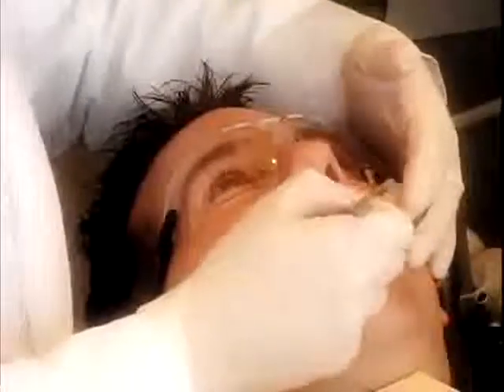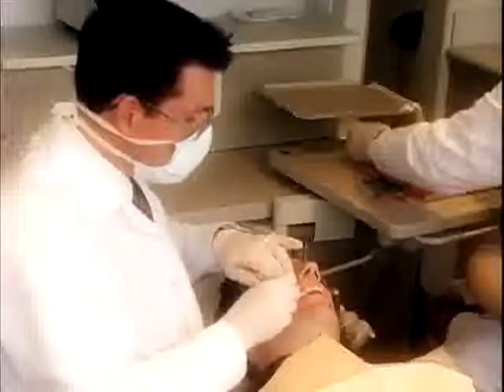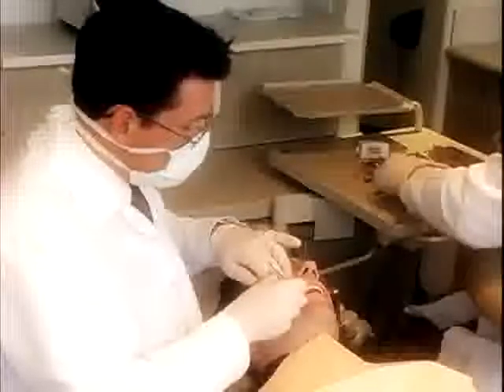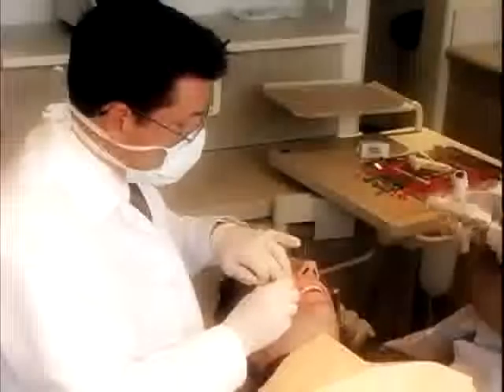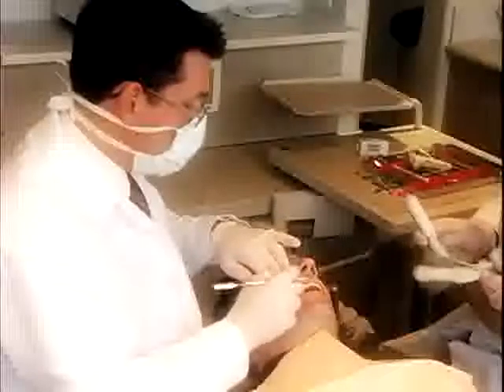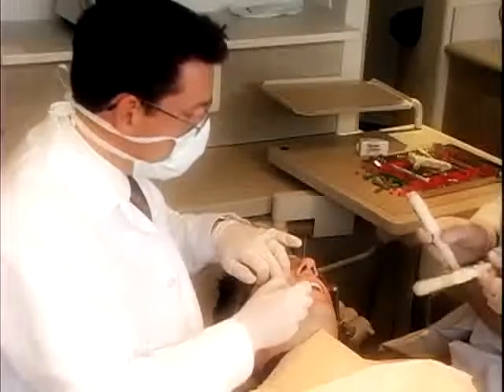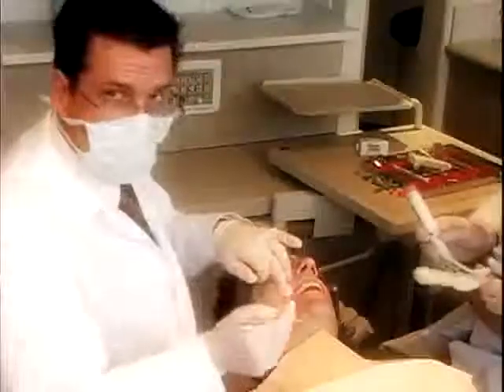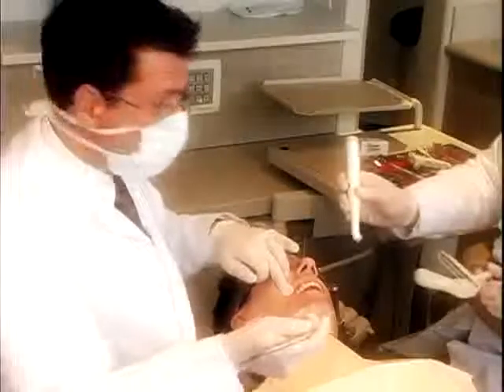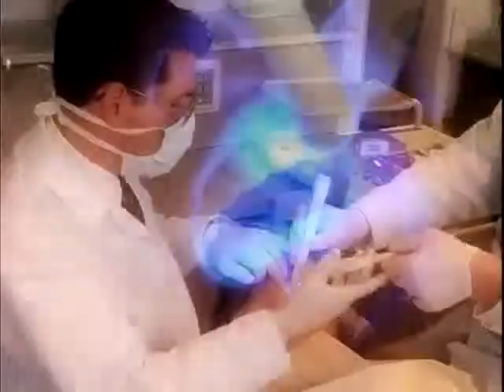Simulations of this type are rather efficient for me to understand what type of restorations are best for you. In instances where reconstruction is required, where you have multiple broken down teeth, we may determine, for example, that a bridge or an implant may be the best way to approach your care. Options in cosmetics are not limited to fixed or cemented restorations, but can also include the use of orthodontics and Invisalign.